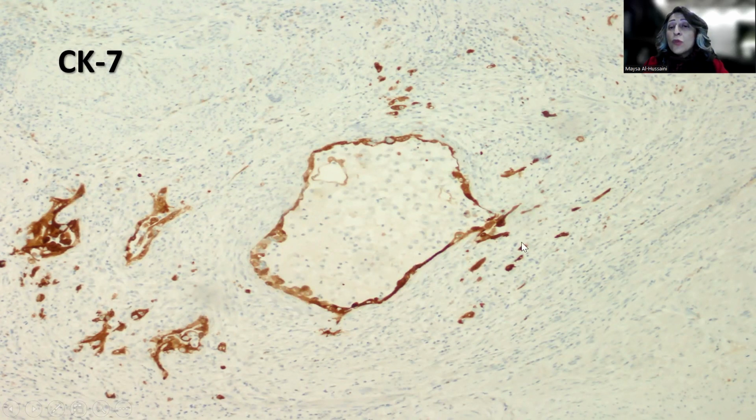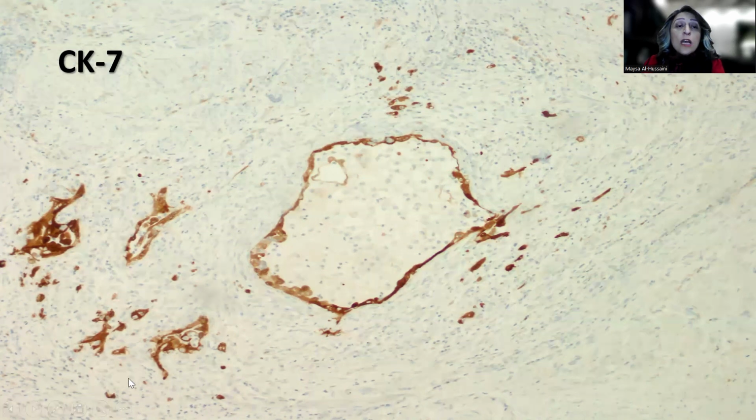And as you can see, this one focus contains a large gland lined by flattened epithelium. But look at the number of individual cells, and from here came the fragmented part of the MELF acronym, because the cells tend to frequently appear as individual cells infiltrating deep into the myometrium.